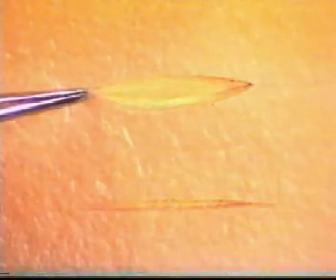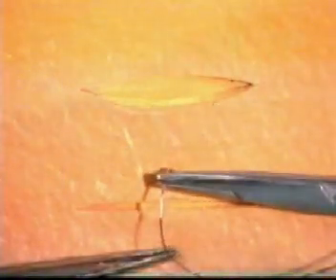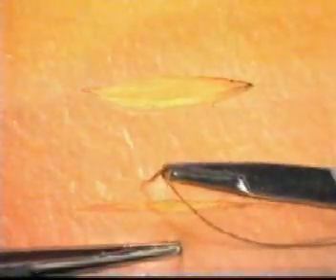If you have to make an elliptical wound, try and ensure that the length of the ellipse is at least 3 times its width. When closing a linear wound, it may be easier to start in the middle of the wound, as you see here, inserting an interrupted suture and then ligating it.